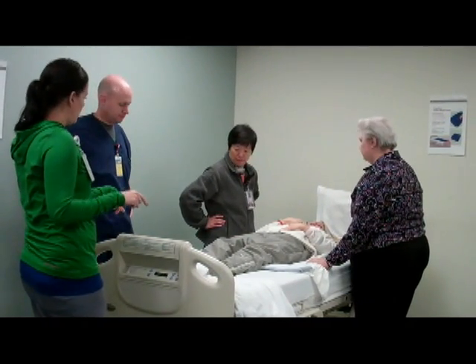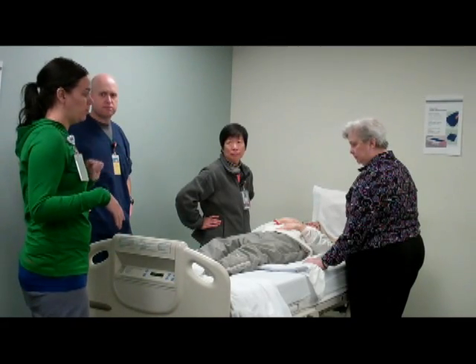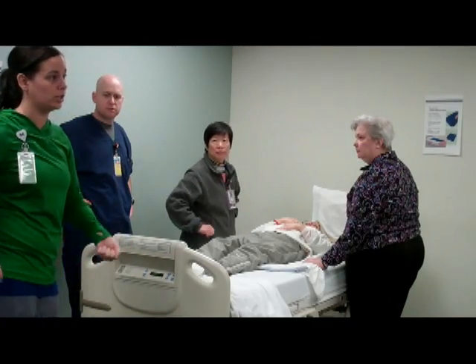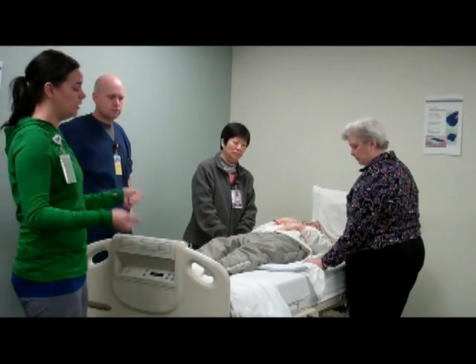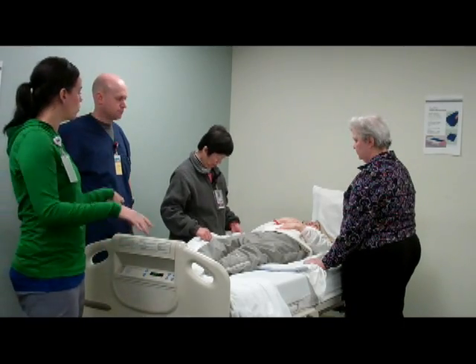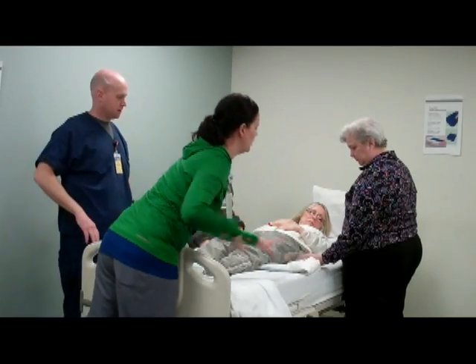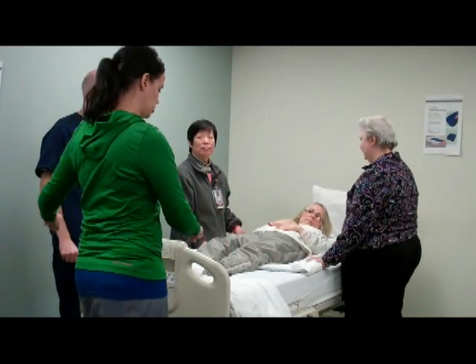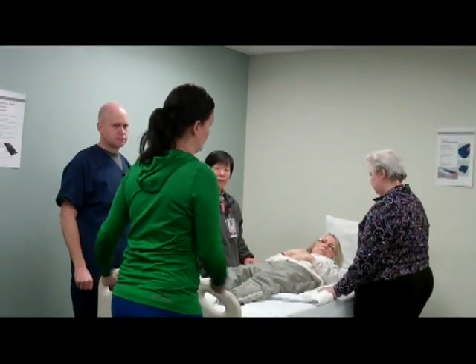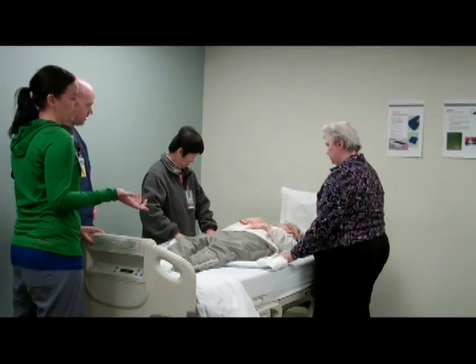And then with these, there is a different technique that we want you guys to understand with boosting somebody up, and it's actually with your knuckles up. We're so used to grabbing those chunks and then just throwing them up in the bed. This action is going to really hurt you in the long run. So if you look over here, she has the sheet already bunched up and rolled, and her knuckles are up, and she's going to boost her like that and step into it, rather than using the force of her upper body to toss her up in bed. Better for the patient, better for your body.